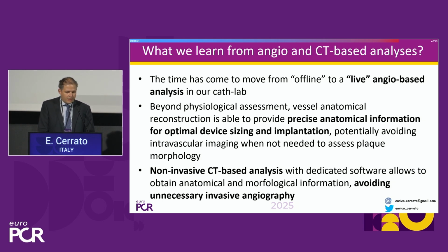It's true that we need intravascular imaging when we need to assess plaque morphology information. The non-invasive CT-based analysis is something that could be feasible to follow up those patients, because we know that using the current software we can properly identify also the area that was previously treated by resorbable scaffold, and we could identify the tantalum marker. We could have good information about the stabilization of the plaque.